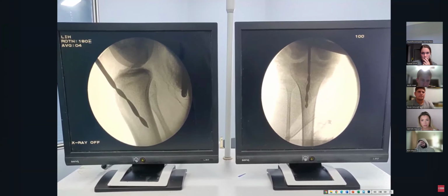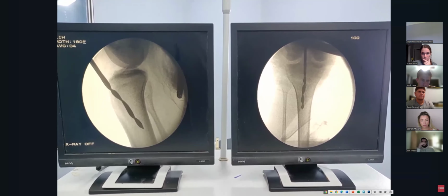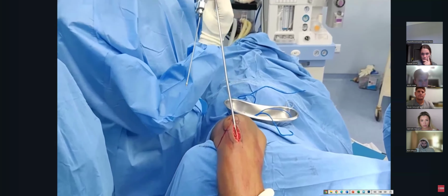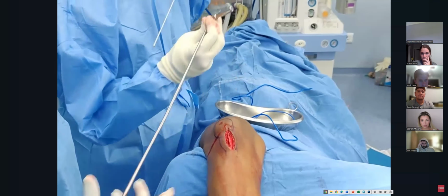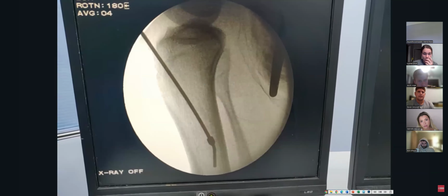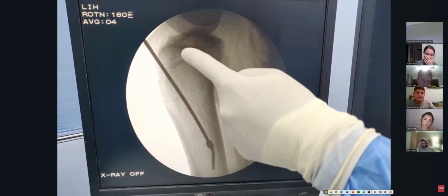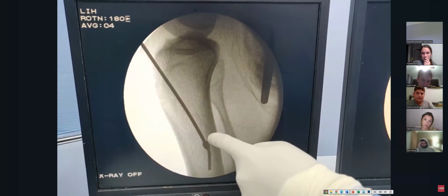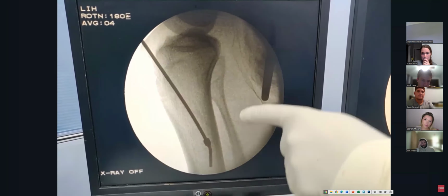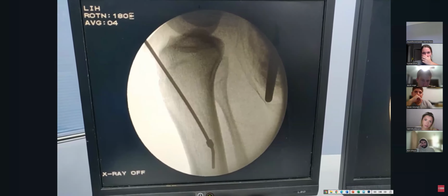It will hit the posterior cortex, and then it will follow the medullary cavity, and I'll show you how it does. So next step will be just take this out and then replace it with our guide wire. So just put it in the same hole. So this is what I meant, that your starting reamer will go like this, but when you put your guide wire, keep the curve front so that it will hit this cortex and it will bounce back in the center of the medullary cavity, and then you're ready to proceed to put it down distally past the fracture site.